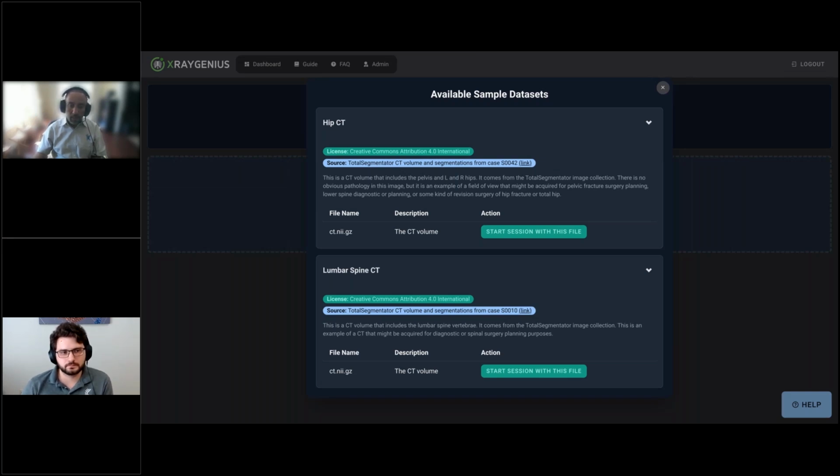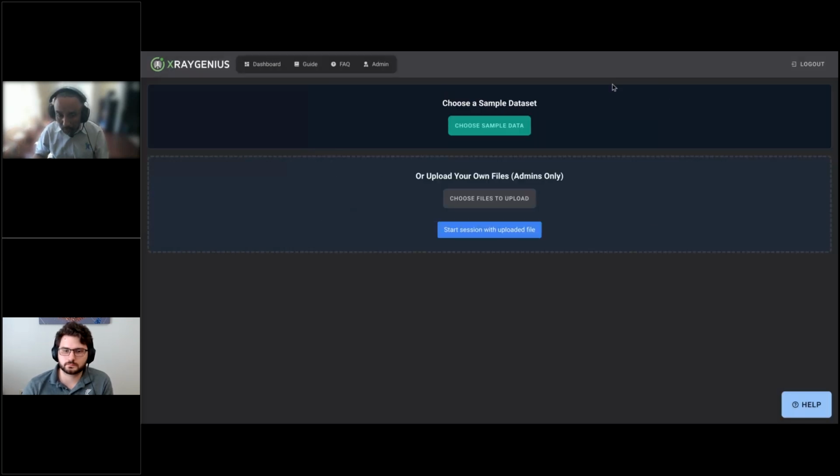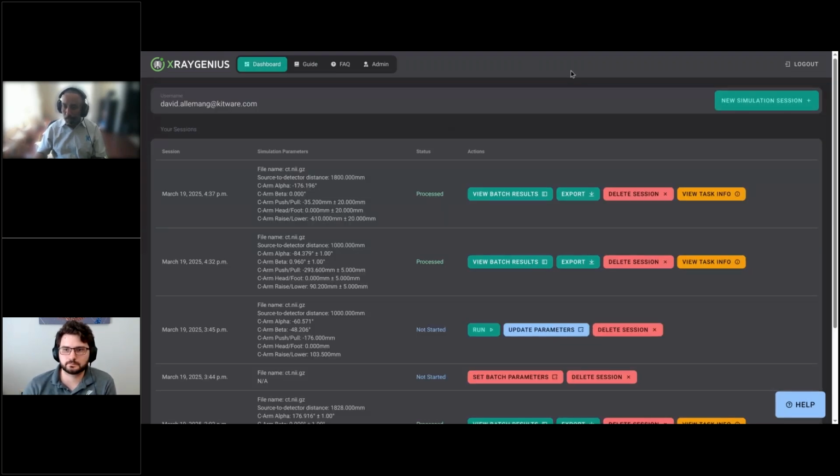So that's one option. Another option we're also looking at is, if there are a lot of users generating a huge amount of extra images, we will be looking into a subscription-based service as well. But that depends on the need out there for potential users. That was a good question. Any other questions before we switch back to me? Any scenario folks want David to give a quick try?